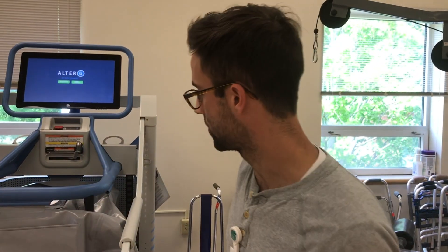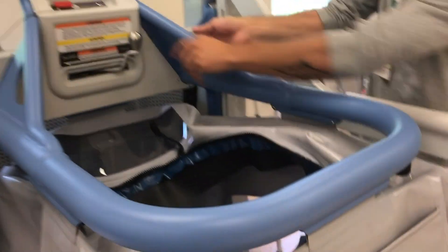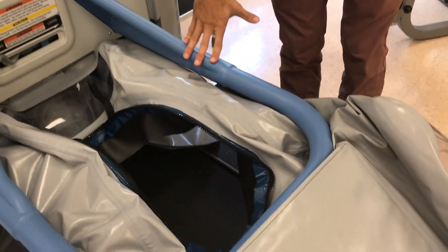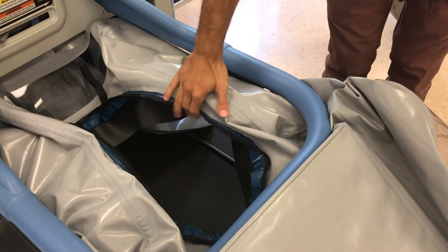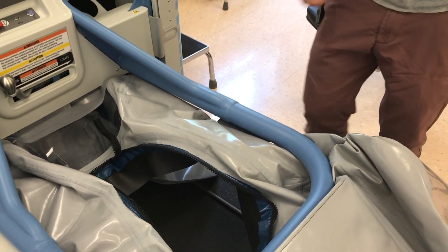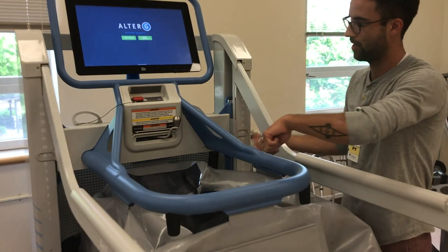We have patients zip in through the top here. I can actually show you. We lower this down all the way — this goes all the way down to the floor. The patient steps on into the middle. They have a Lycra pair of shorts on that zips in, and we pull it right back up to the top and zip them in.